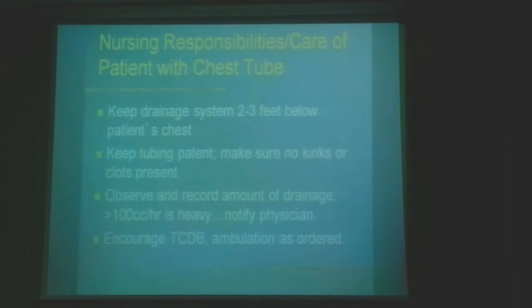So this tube will work by gravity. Imagine that I'm putting in a chest tube, and the underwater seal maintains my negative pressure. Imagine that I raise my underwater seal above my chest. What will happen? The fluid or the air will come back inside my chest, right?